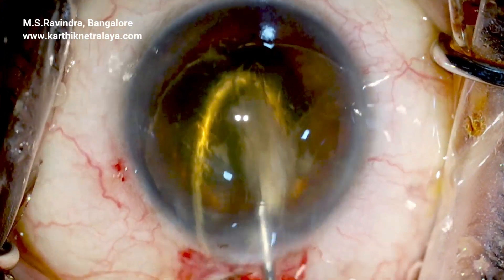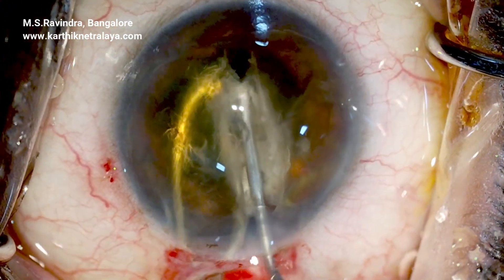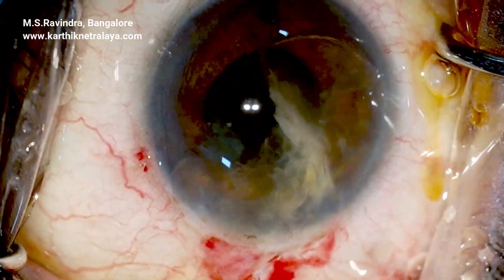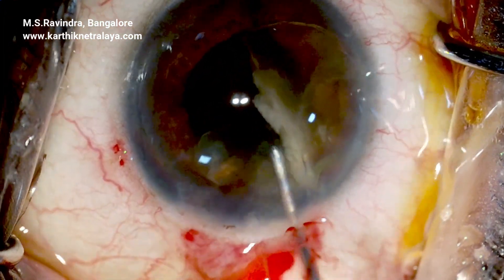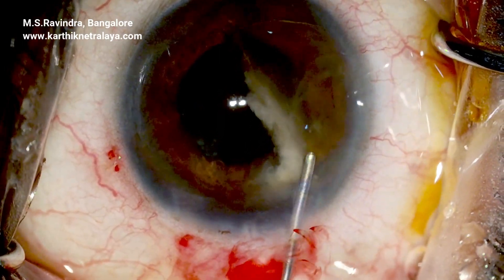The nucleus is bisected with the shaft of a 25-gauge cannula, which continuously injects visco-HPMC into the anterior chamber in front of the nucleus, maximally protecting the endothelium. The leftover cortex of each hemi-nucleus is then visco-expressed.